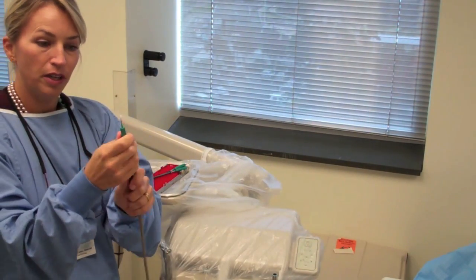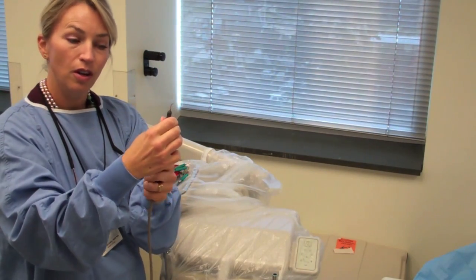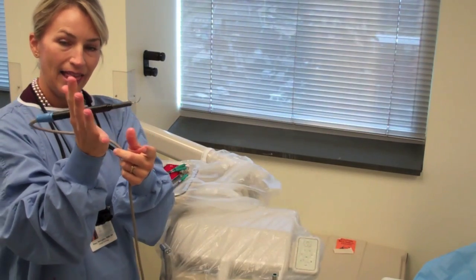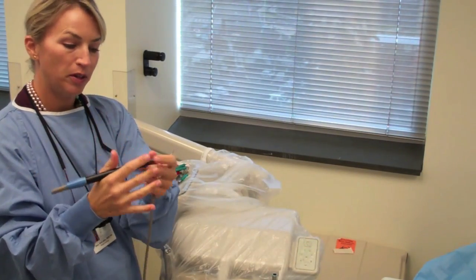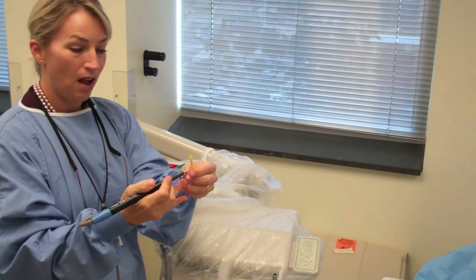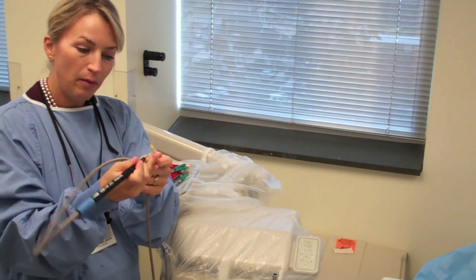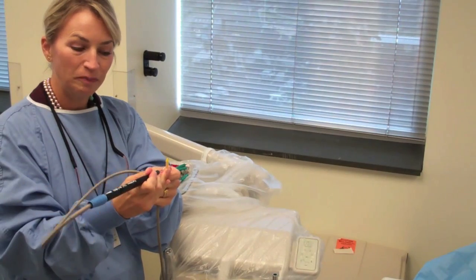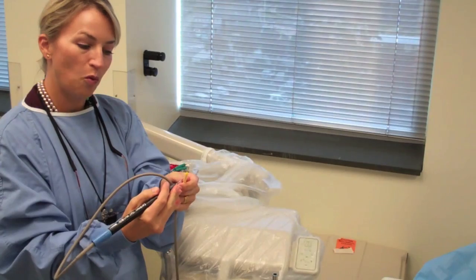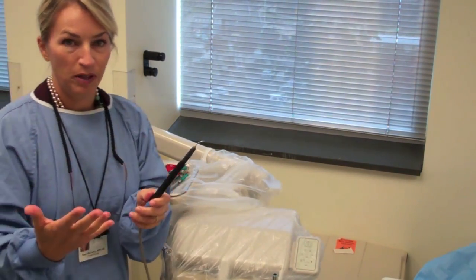That's whether you're using your Slimline insert or an insert like this. This is a really good insert for your periodontally involved patients or patients with heavier deposit. Again, you're going to want to hold it like this, in the web between your thumb and your index finger. The exercise where you use the candle, for me it was really a big aha moment because it made me realize over the years I had been pinching and using my ultrasonic insert like a hand scaler, and that's not how they're used. So relax it like this and gently remove the white part of the candle stripe, not the yellow part of the candle stripe. So the grasp is really important.